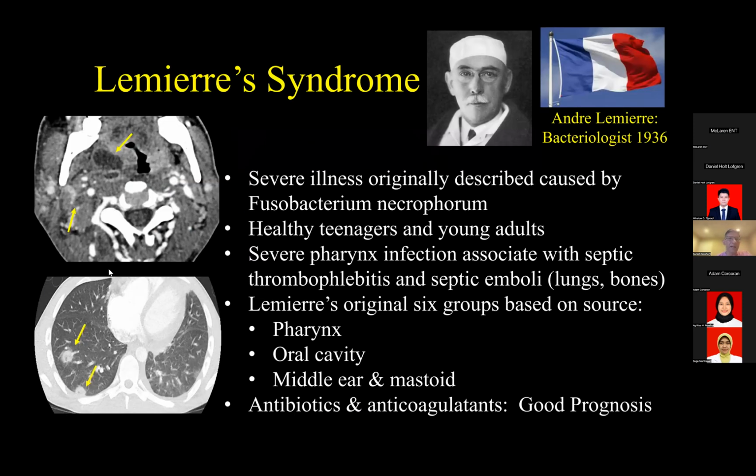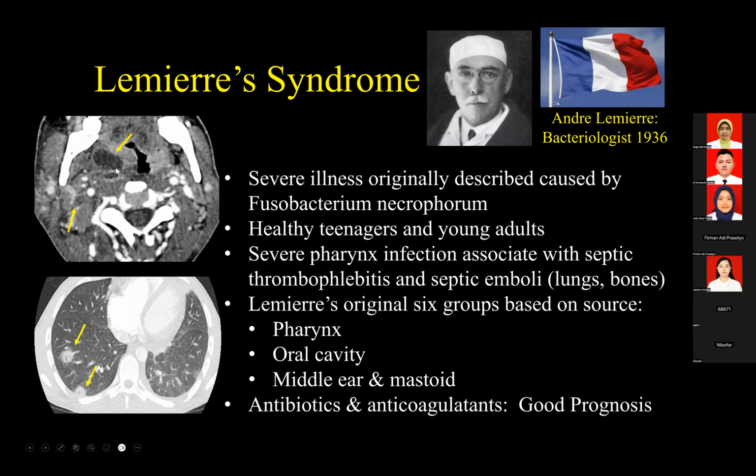And the last thing that we'll talk about when we talk about infections involving the head and neck is one syndrome that's associated with tonsillar abscesses. If you do have a tonsillar abscess, and this is something that shows up always for the radiologist on our boards, if you will, and I'm not sure how, as the ENT surgeons, you're exposed to this, but anytime you have a patient that comes in with a tonsillar abscess, some of the things that you want to specifically look for is to make sure there's patency involving the great vessels of the neck.